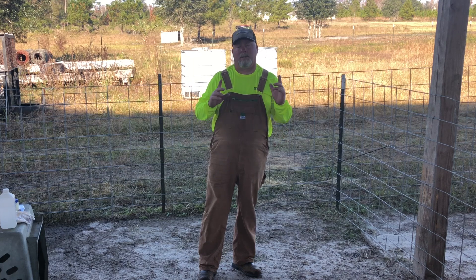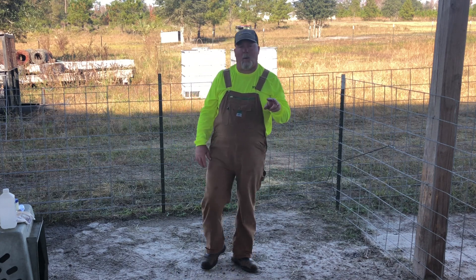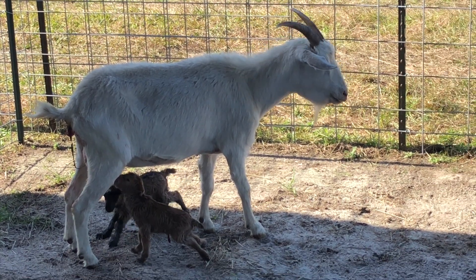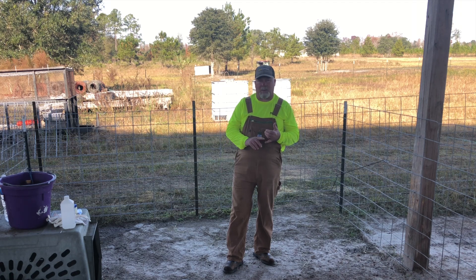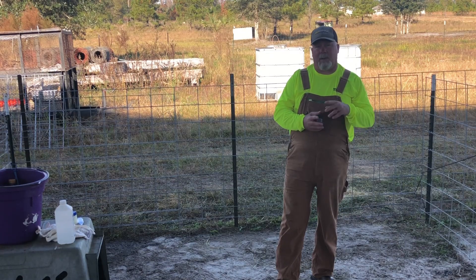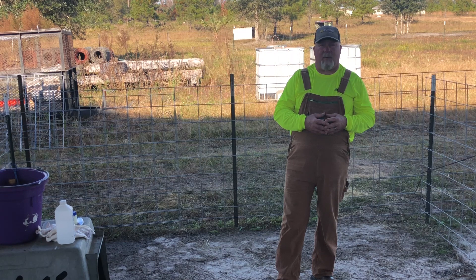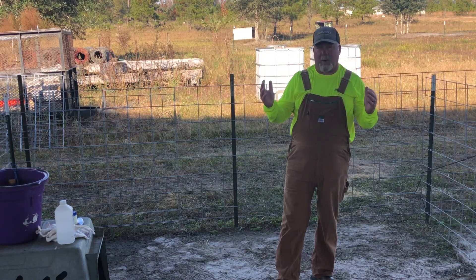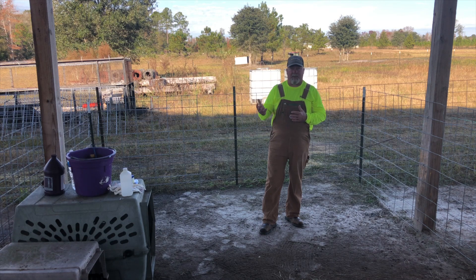We're going to take the temperature of this three-year-old Kiko doe. She had a set of twins a week ago today. After three or four days she had a few issues — she kind of stopped nursing as much, was dodging the kids, acting a little lethargic. We checked her FAMACHA scoring and her parasite load was up, so we went ahead and wormed her a couple of days ago and did some general maintenance and aftercare. Today we're going to check her temperature to make sure she's within range. The normal range for a goat is about 101.5 to 103.5°F — a pretty tight range. Just like humans, they can have a low-grade or high-grade temperature; high-grade is a sign of some form of infection.